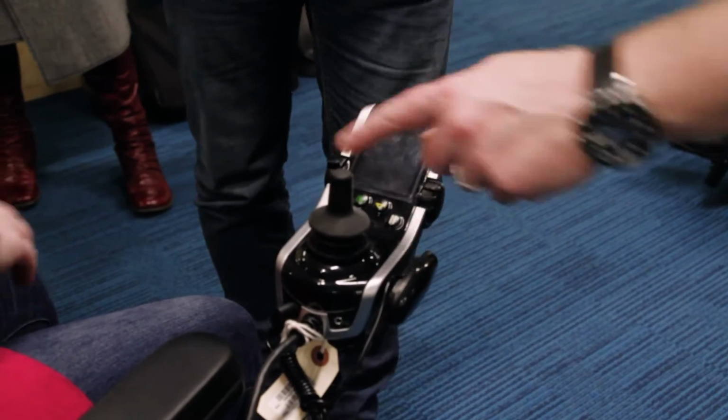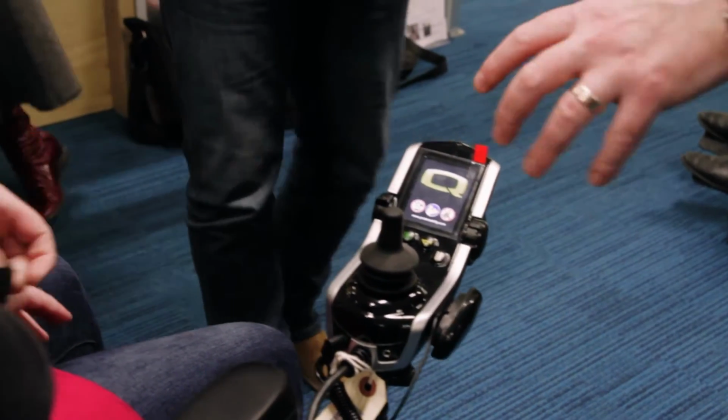There's also the option of 3-directional driving, and now I've never actually used this, but Nigel was filling me in, where your forward and reverse can actually be the same way. So you've got left, right and forward, and then you can use your mode switch to bring forward to then become reverse, much like your 3-switch driving. So same principles, but you're using it through a controller.